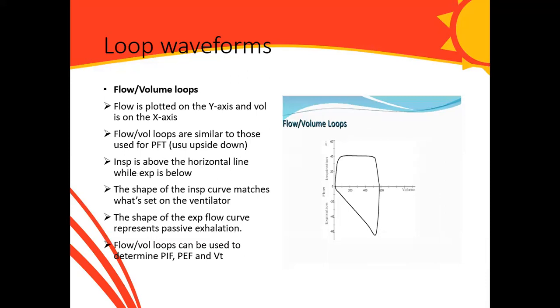Flow versus volume. Okay, this is what looks more like the spirometry loop waveforms. All right, you can see that the flow volume loops are similar to those used for pulmonary function tests or lung function tests, but it's usually upside down for this.